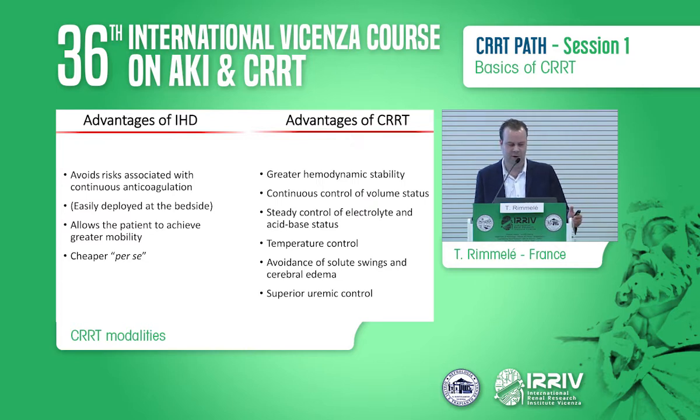Intermittent hemodialysis allows the patients to achieve greater mobility. And if we take only the therapy by itself, the machine and the circuit and the membrane, then IHD is cheaper than continuous renal replacement therapy.